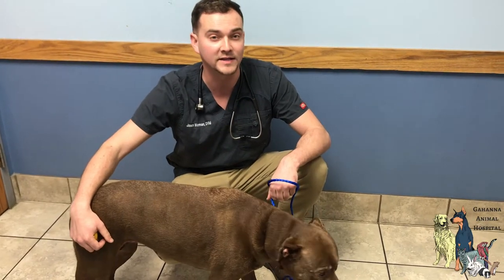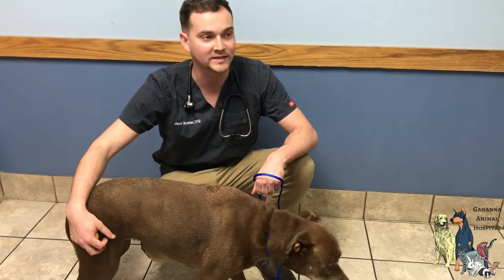Today we are going to cast her leg and send it out to the company so that they can send us a custom knee brace. We're about to get started.